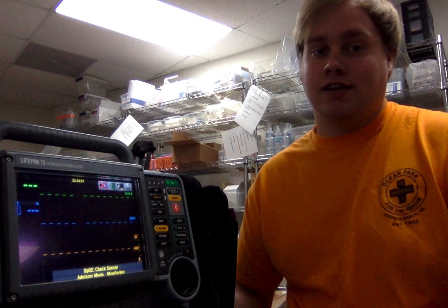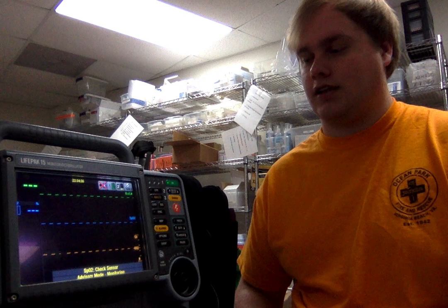Hi, my name is John Shepard. Today I'm presenting to you the LifePak 15, to show you why it's the best monitor and AED to purchase for your healthcare facility.